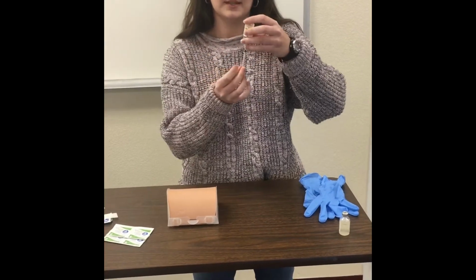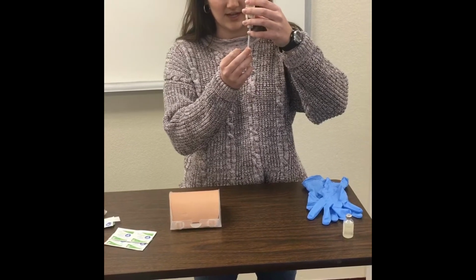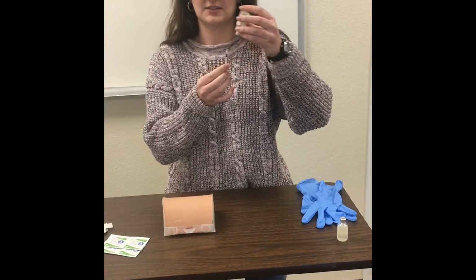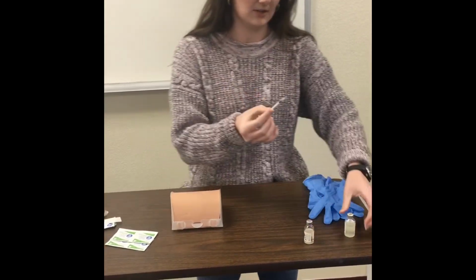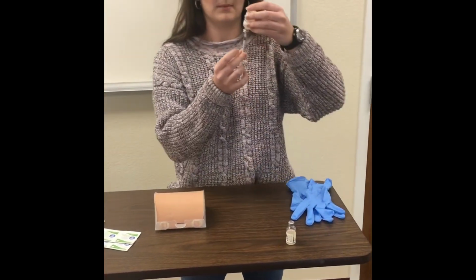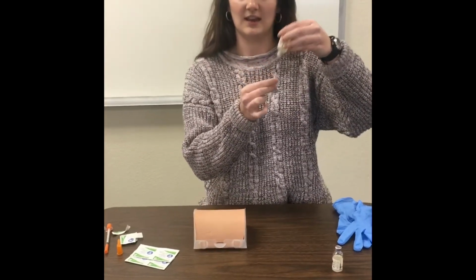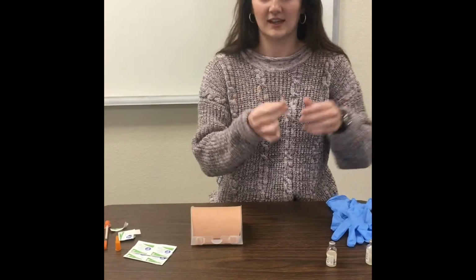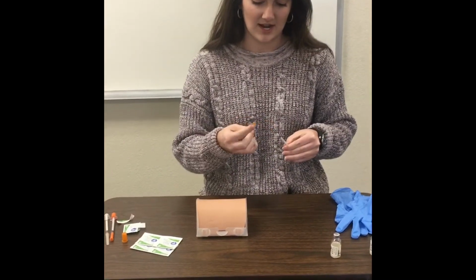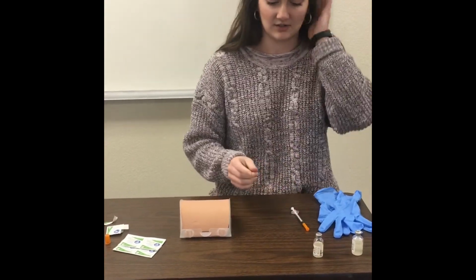Then we're going to turn this upside down and draw back 3 units of the clear, and then we're going to check with the verified nurse that that's 3 units of the clear. Then we're going to go into the cloudy and draw the remaining 2 units of the cloudy, and check again with the verified nurse that we have the right amount. We're going to recap this, and I'm going to double check the drug's expiration date and that I have the right medicine, per the doctor's orders.